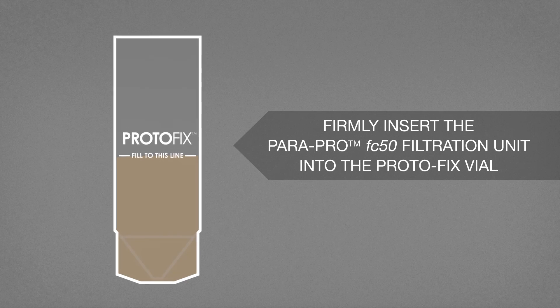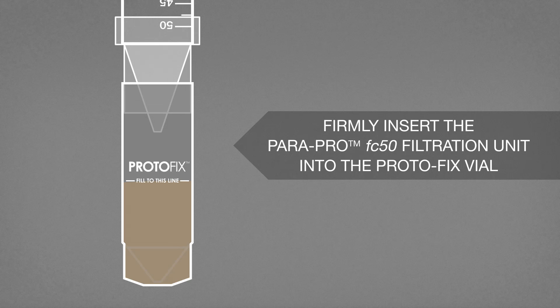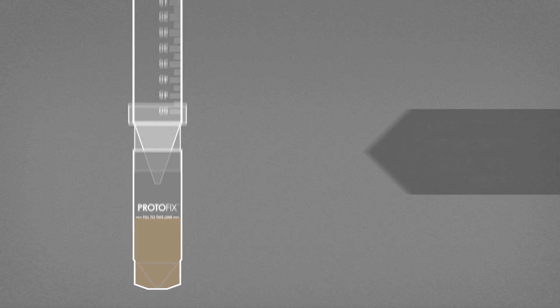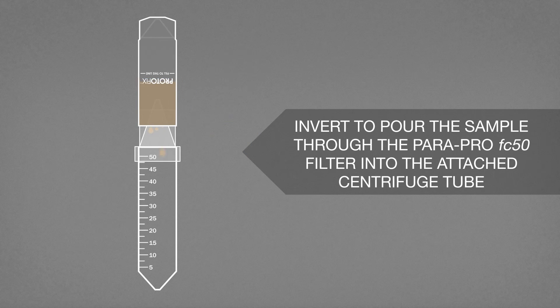Firmly insert the ParaPro FC50 filtration unit into the Protofix vial. Invert to pour the sample through the ParaPro FC50 filter into the attached centrifuge tube.